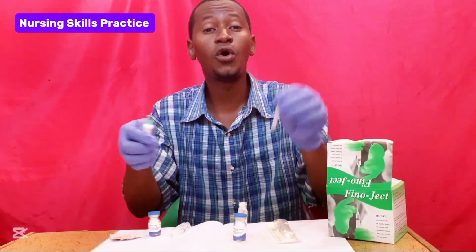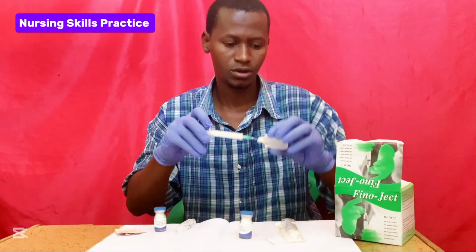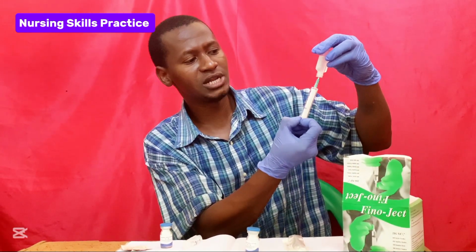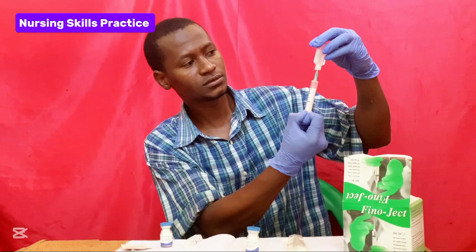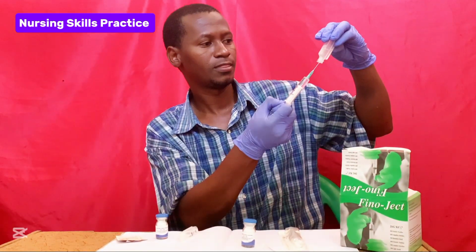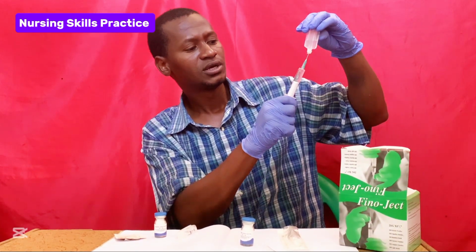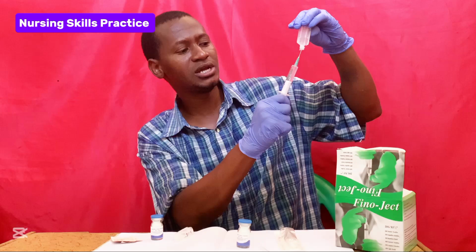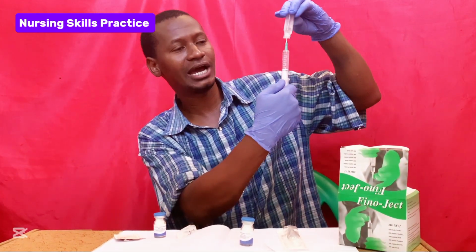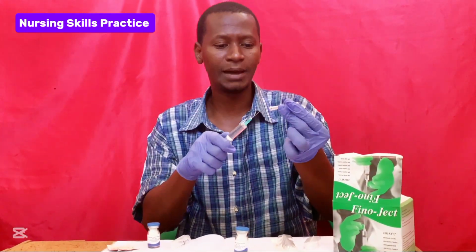You withdraw 4.7 ml. Make sure you withdraw only 4.7 ml of sterile water for injection when you are preparing the 500 milligram powder for injection. I hope you can see the 4.7 ml. Then you put back the cap of the needle.